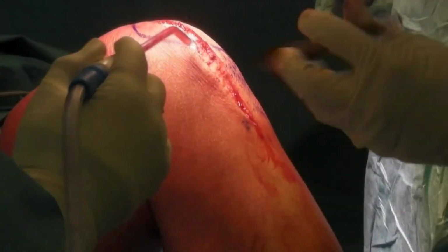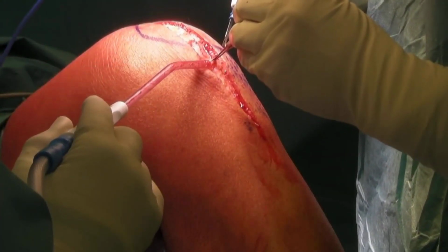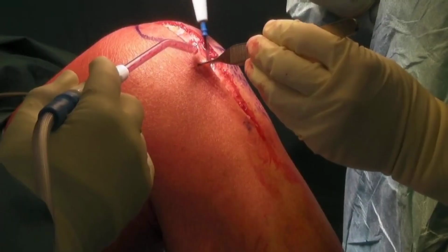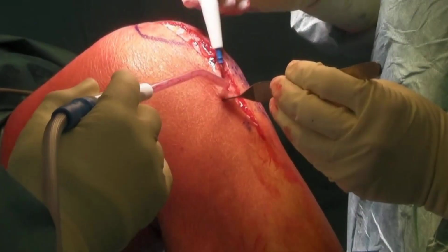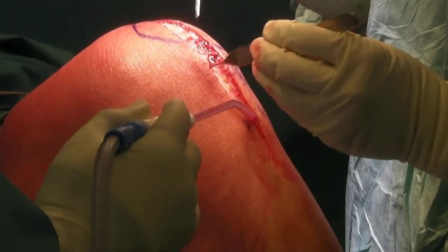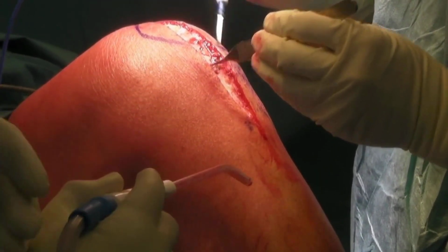In fact, it only takes a few extra minutes to accurately identify and close the bleeding vessels, with the undoubted advantage that the thigh muscles are not compressed by the high-pressure pneumatic tourniquet, which is an additional trauma for the muscles.